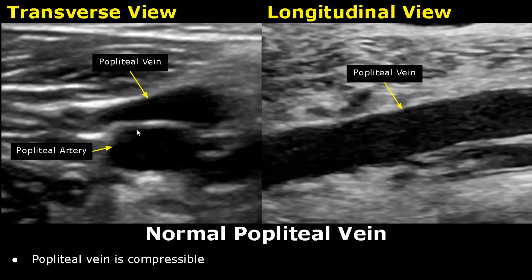Here is a transverse view showing the popliteal vein. The vein is compressible and will collapse when we apply probe pressure, whereas the artery will be pulsatile and is not compressible. And this is a longitudinal view of the popliteal vein.